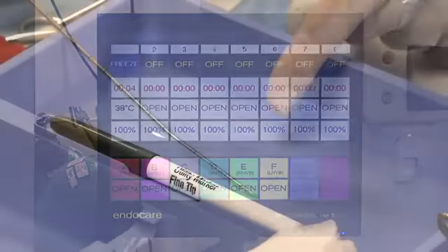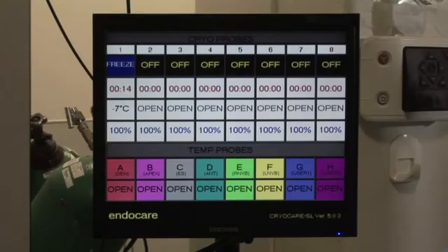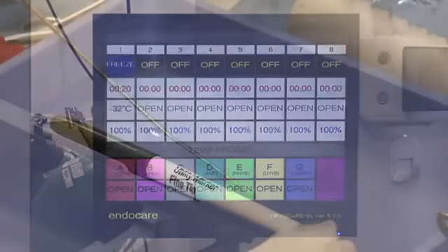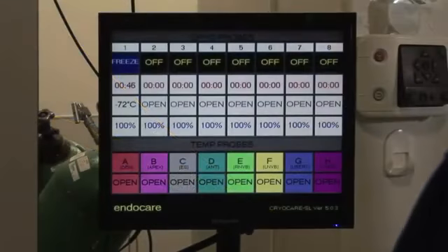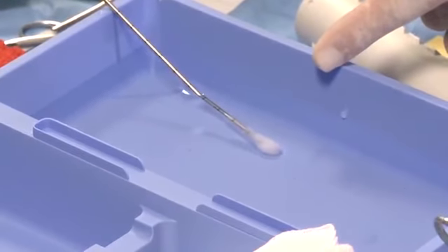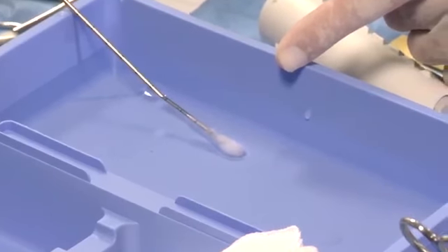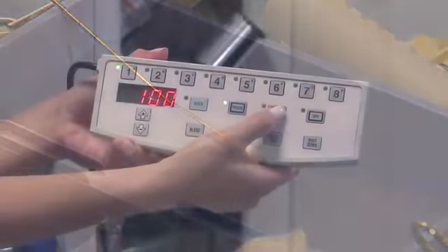The monitor is starting to form an ice ball now. The monitor should show minus 20 degrees by 20 seconds as a rough mark or measure of probe success. I've never seen it not work that way. See the ice ball forming on the end of this probe. We go for 30 seconds. We're at 50. Okay, so now we'll thaw this. Thaw.